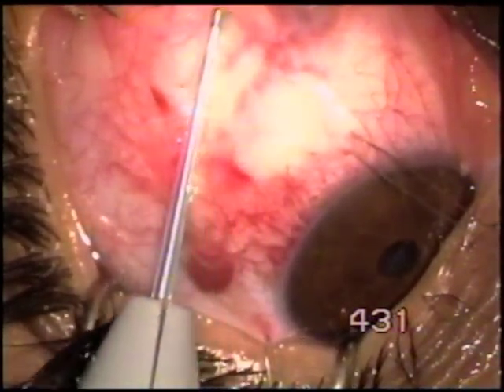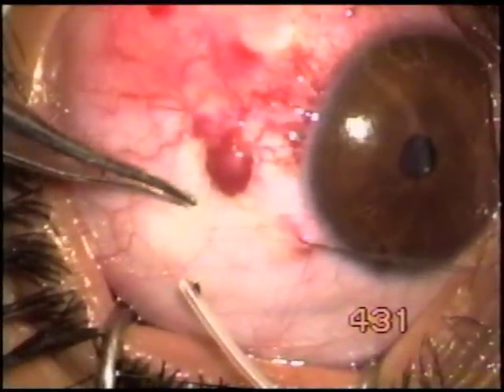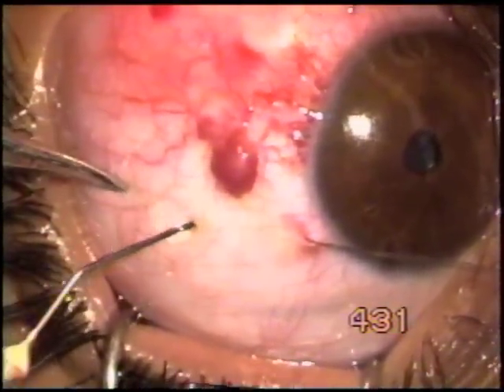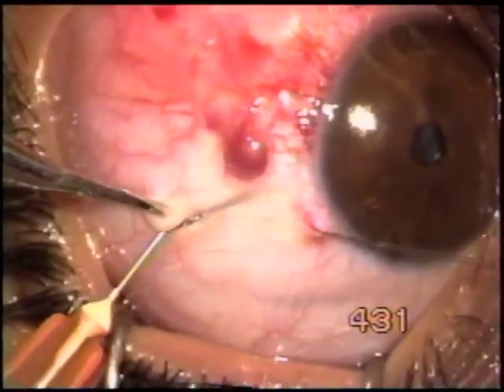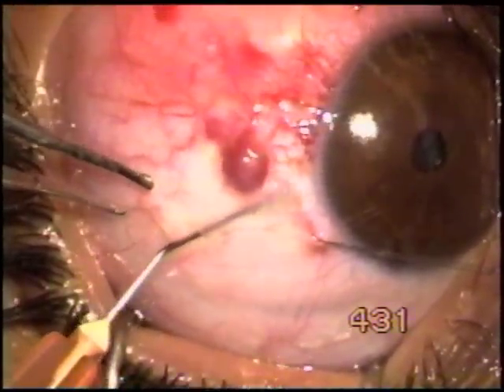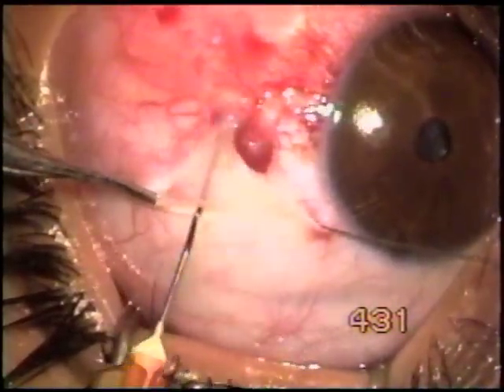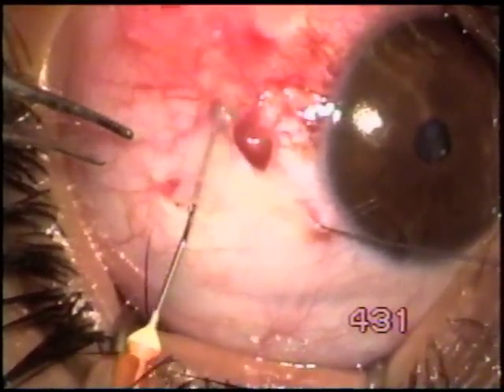So I think that we have been able to manage the feeding vessel which was coming from below. There may be many feeding vessels we do not know, but that is what was visible to us.